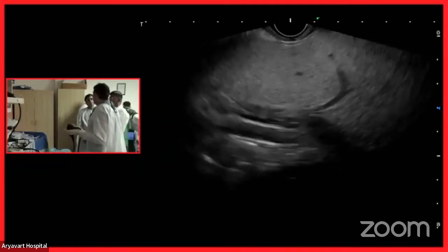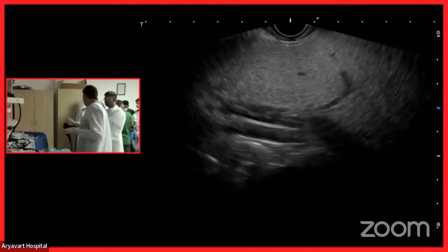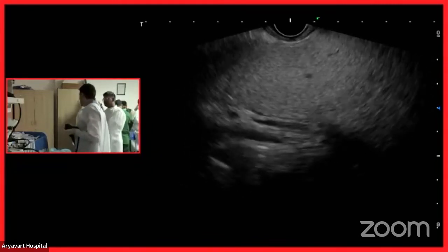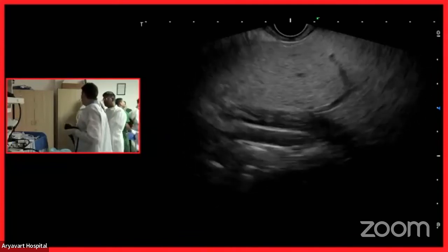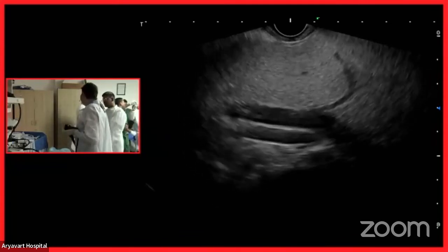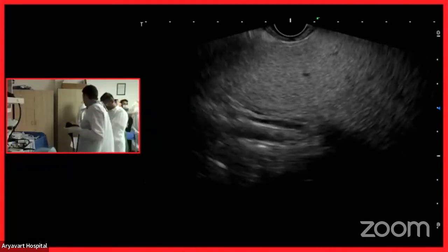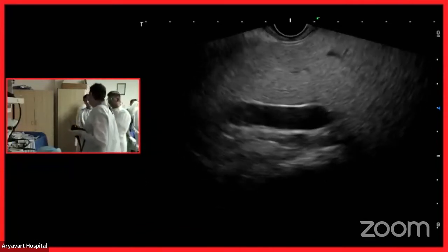Normally bleeding doesn't happen because we see it under EUS. Suppose it happens, what the IR people do is they keep the needle there. Either they use gel foam or sometimes a glue to embolize the tract. Normally they use this for patients who have a shrunken liver.